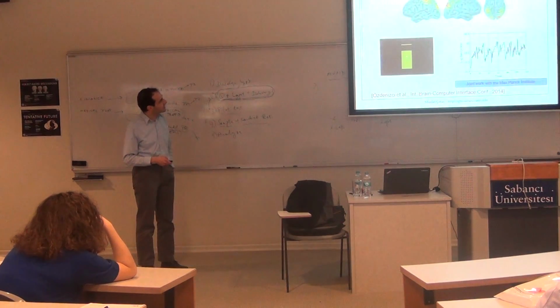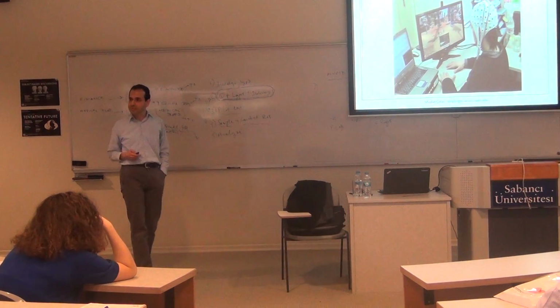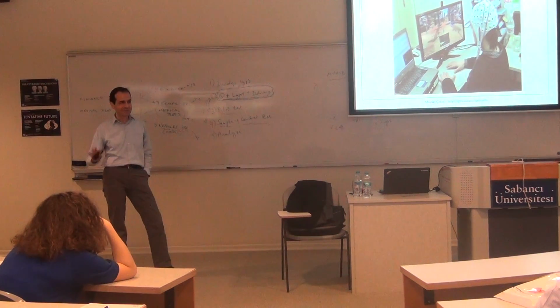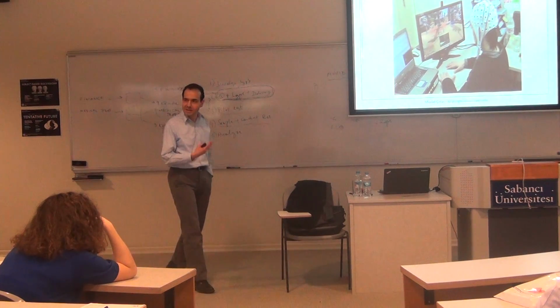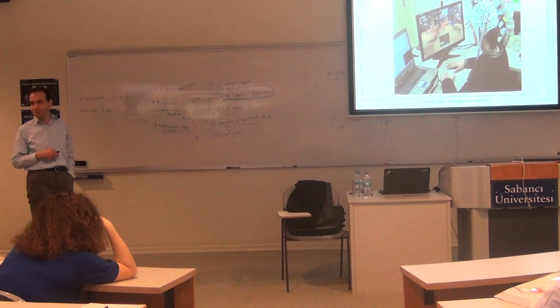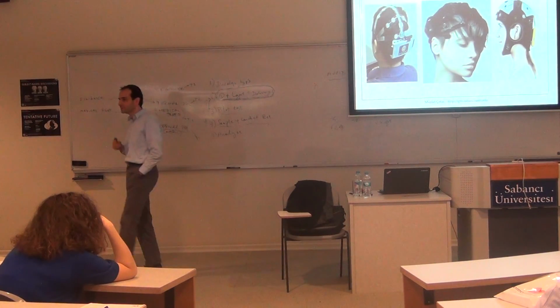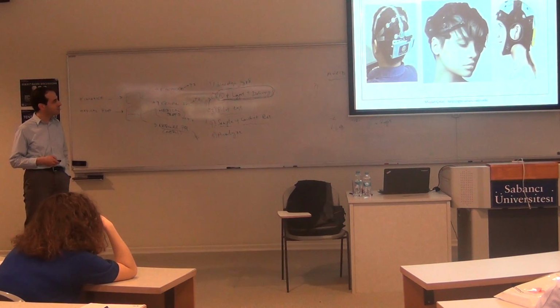Okay, so there are other things that my group is not doing currently, but these are some trends that you should know. One is use of BCI in gaming. This is an interesting research area, but of course in things like this, there's also lots of fiction rather than science, so be careful. In some cases, what they are recording are not really brain signals, but they pretend they are. But there's serious work as well. It's a very interesting area. Another one that's kind of trendy is wireless BCI systems that are fashionable, which is also another interesting direction. This is important for practical use of these types of systems.